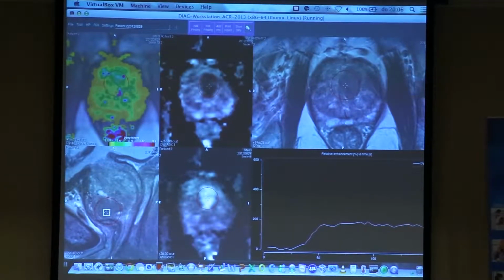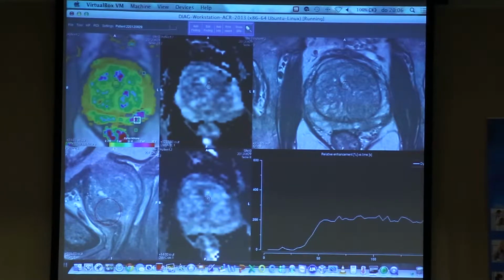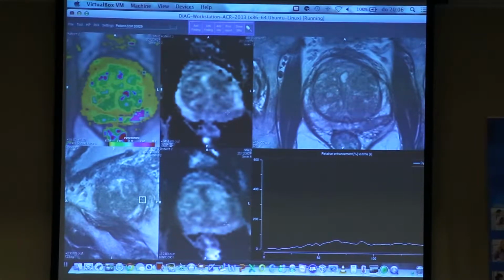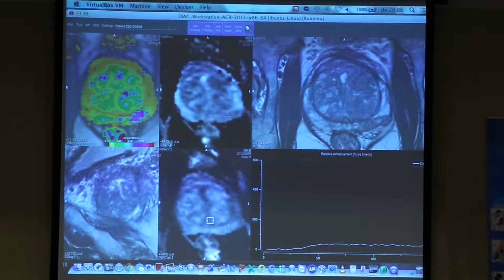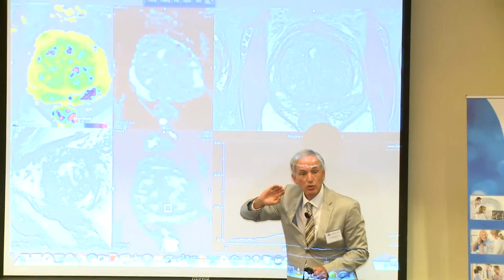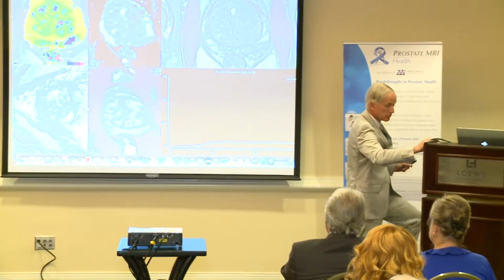Now let's go up. Okay, Joe. What do you think about this area? Enhancing a bit. It is perhaps a little bit focal. Let's have a look a little bit up and down. Okay, this is here a focal lesion. You can see that, and I will move this cursor. You can see that there's something going on over here. This is white. This is dark. Dark here. Score T2? 3 or 4?